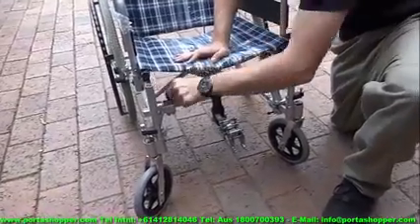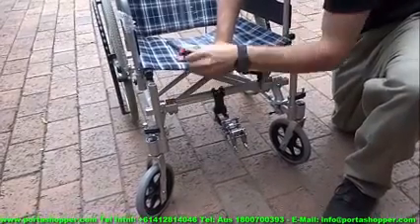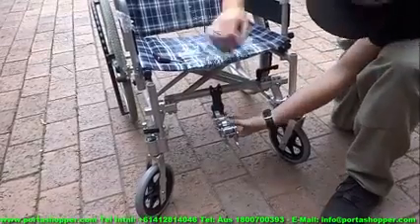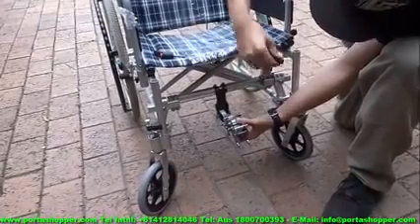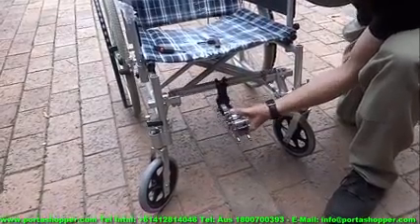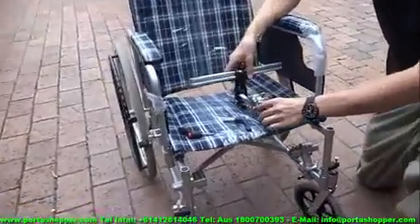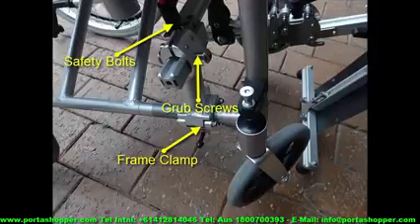Also remember that when you want to fold up your manual wheelchair, all you need to do is remove the tow hook crossbar by simply undoing the two safety bolts keeping the crossbar locked into the frame clamps. Just leave the frame clamps attached to your wheelchair and fold it up, and it will not interfere with the folding mechanism at all. Once practiced, this literally takes less than a minute. Furthermore, make sure all these bolts and clamps are tightened properly for safety's sake, as well as to ensure that you don't have too much flex on the tow bar.